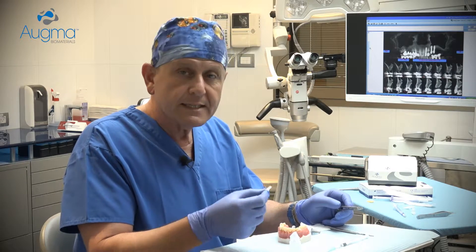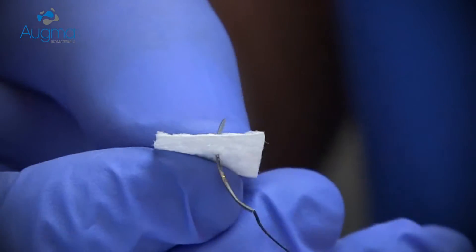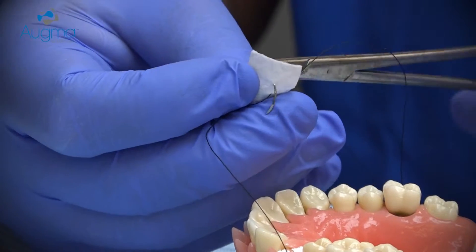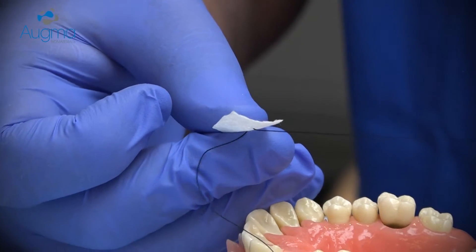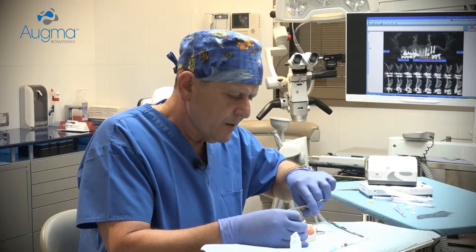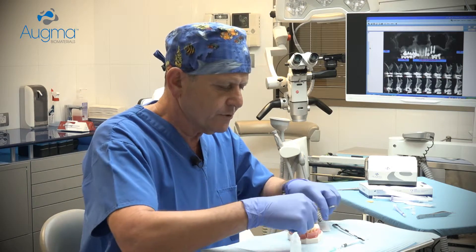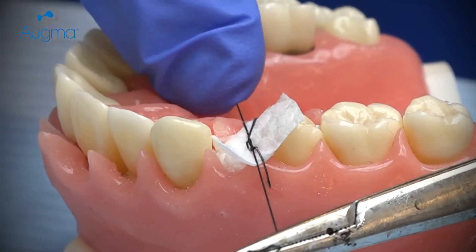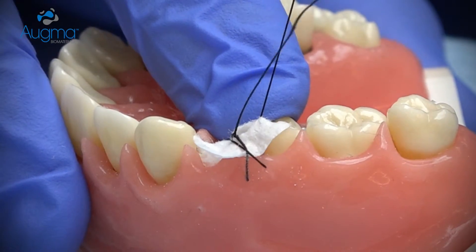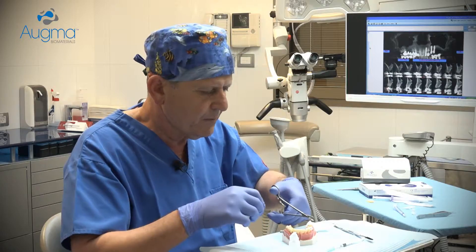The technique is very simple. Insert the needle from the buccal aspect. Hold the collagen sponge in your hand and insert the needle into the bottom side of the collagen sponge, then from the upper side down. Insert the needle into the lingual aspect of the soft tissue and place the sponge above the socket. Make your first suture, then continue with a criss-cross suturing to hold the sponge in place, and make your second suture.